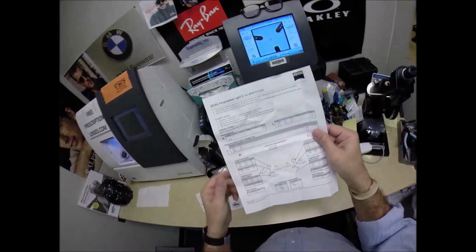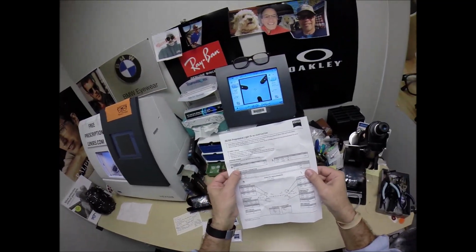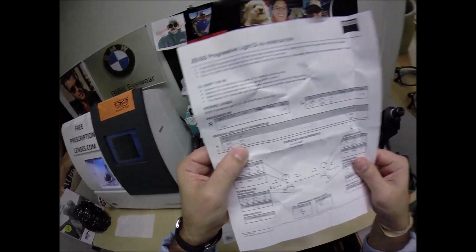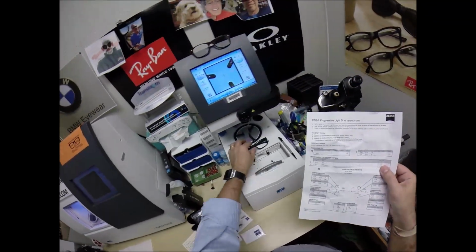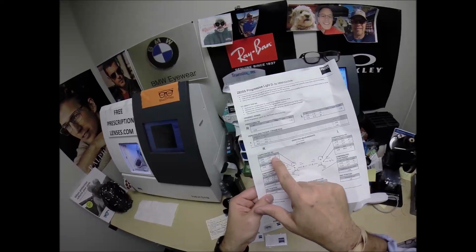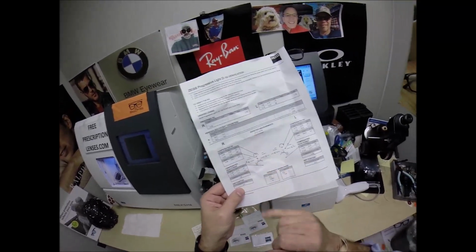So the next time you go to the doctor and they ask what you're wearing, give them this. It's got the power for the right eye, the power for the left, your PD, the seg height 19. Don't believe me? The base curve, which I selected to fit best into this frame. And then, being a digital freeform progressive, it's got the compensated RX for your distance, for the near power, the positioning, the inset of the lens.